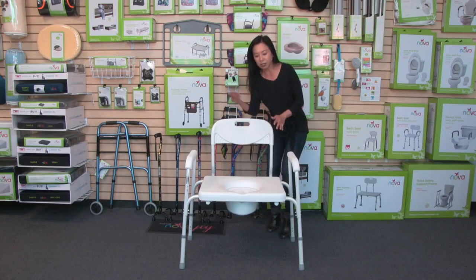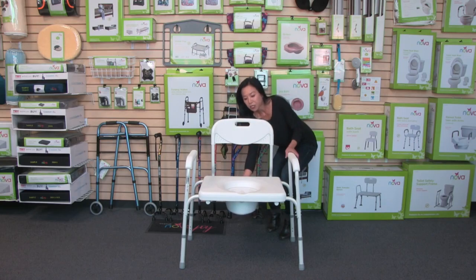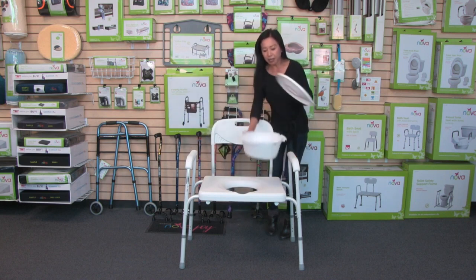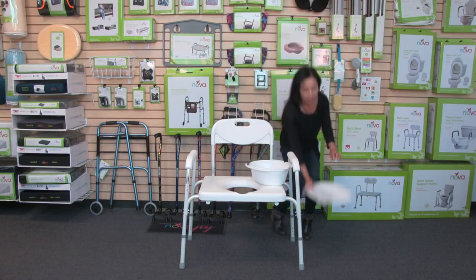The commode bucket and lid are already attached underneath the seat. The nice feature is that the commode bucket can slide out from the back — just like this. Here's the bucket and then the lid, and that is also where you will find the care, use, and contact information.